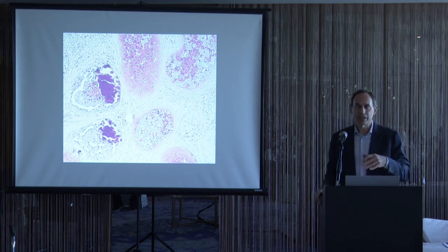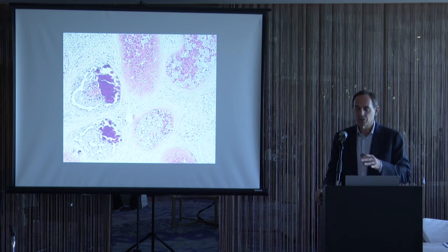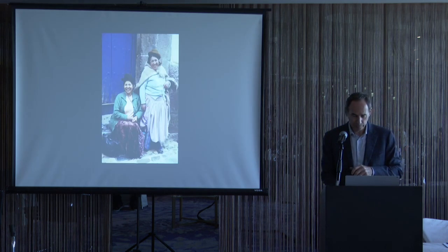As with intratubular seminoma, most of the time when you see intratubular embryonal carcinoma, there is also invasive embryonal carcinoma, but occasionally this, again, can be a precursor lesion without invasive tumor. This is from Peru.